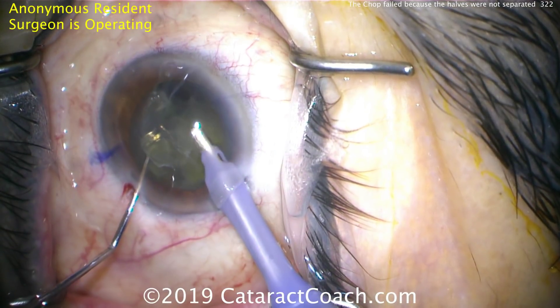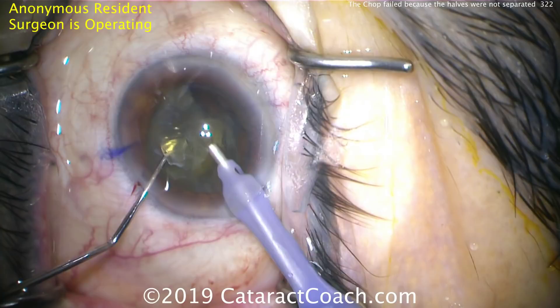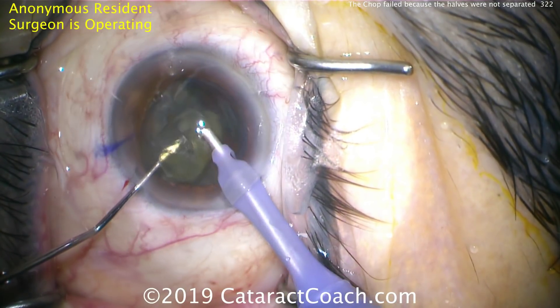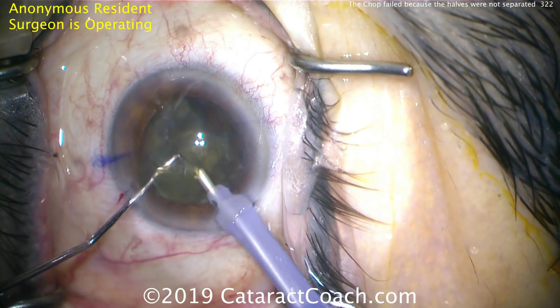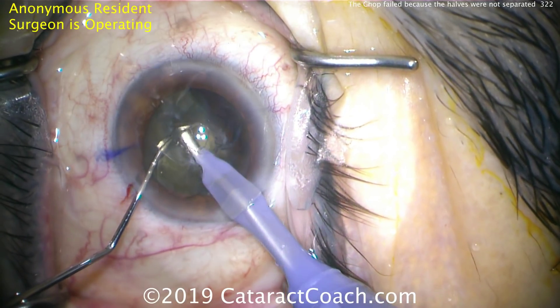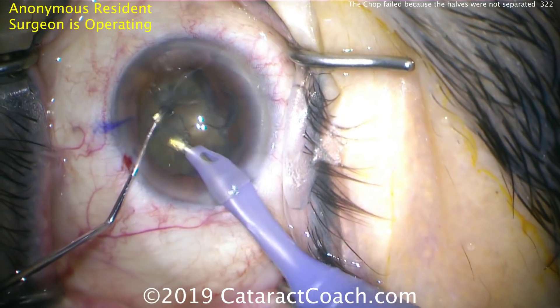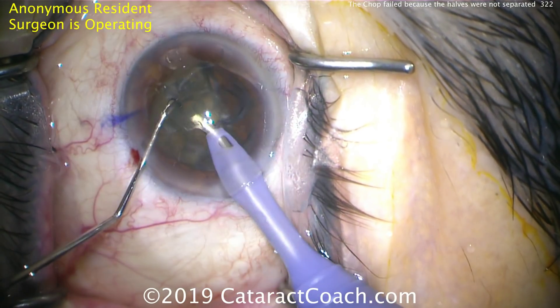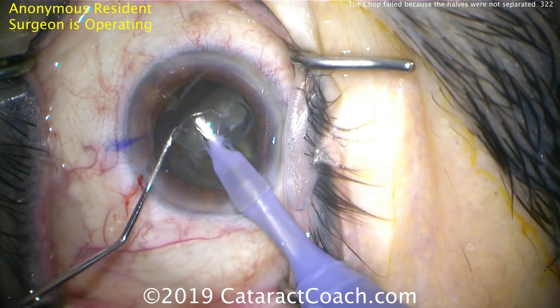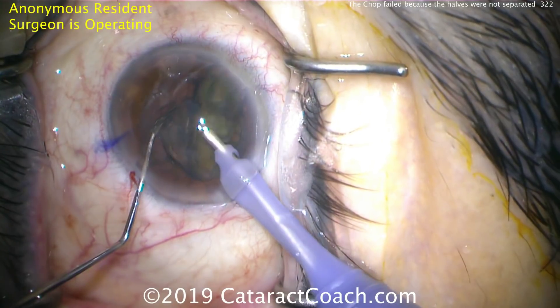The danger here is that you'll go through the nucleus and hit the posterior capsule — and in this case, that actually happens. Watch carefully, it's very subtle. During the case, when we went out to the periphery to vacuum into the nuclear half, the phacoprobe went through the half and nailed the posterior capsule right at the capsule bag equator.